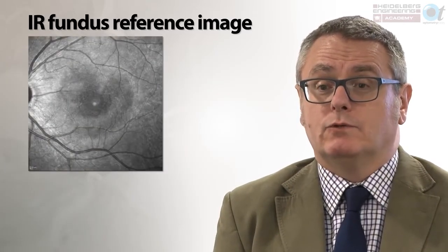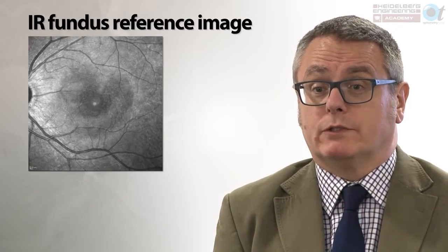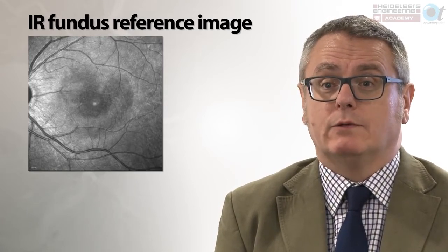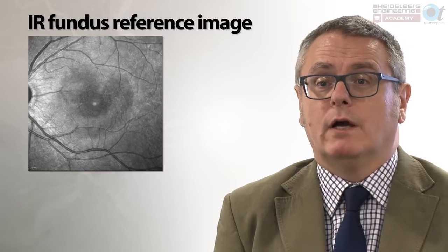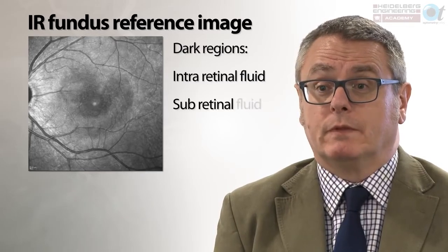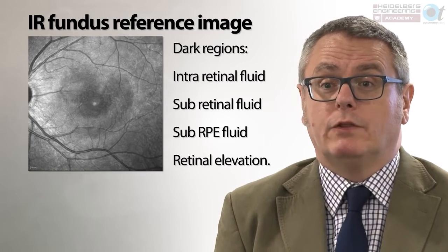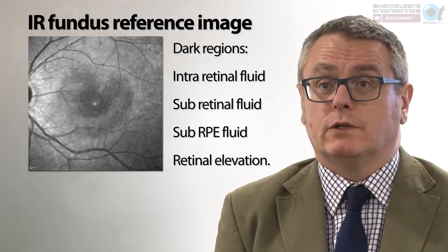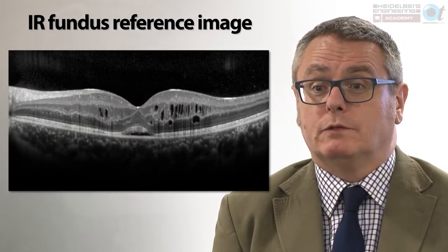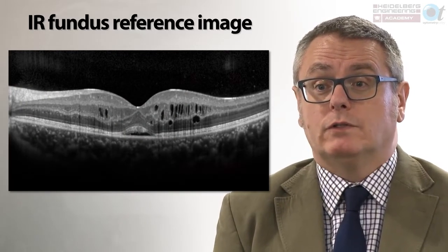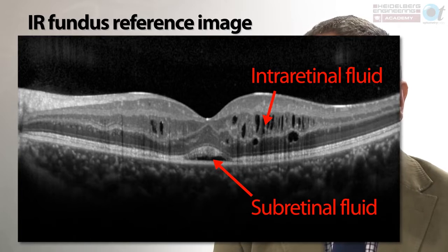Here we have an example of an elderly gentleman who recently underwent cataract surgery with a good visual outcome. Approximately six weeks later we can see an area that is heart-shaped but darker within the fundus reference image, showing an area of absorption of infrared light. The most likely cause is fluid within the retina, underneath the retina, or underneath the RPE. Changes in infrared reflectance can also be caused by pigmentary change associated with the retinal pigment epithelium or disruption to the photoreceptor layers. The OCT confirms evidence of intraretinal fluid and subretinal fluid on the cross-section, clearly manifest on the high magnification image.